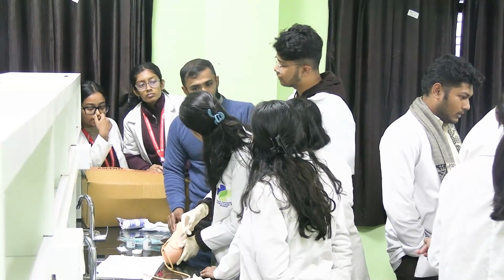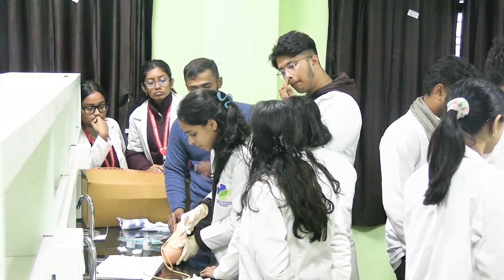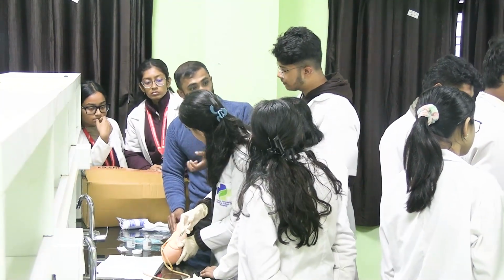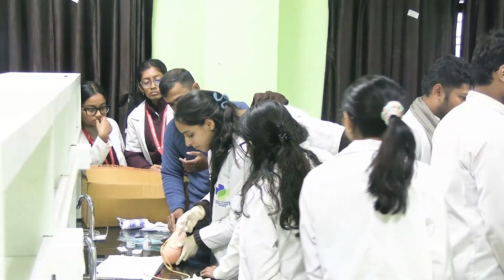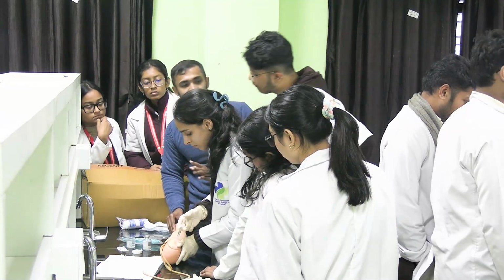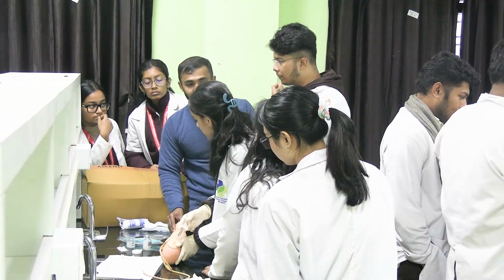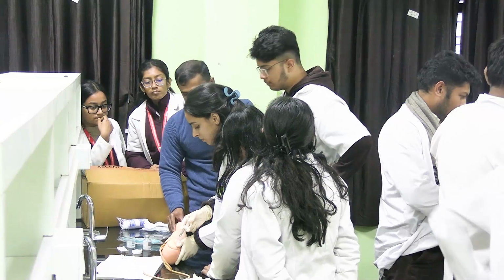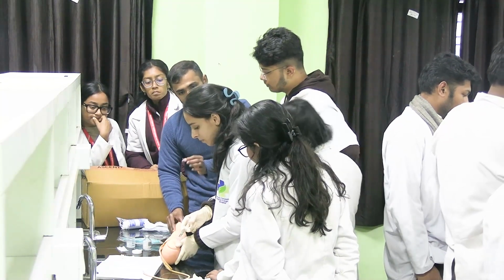We have to check whether it went into a blood vessel, because the muscle is more vascular, with more blood supply. To check, we have to aspirate, or withdraw the plunger. If blood comes, then we'll back off, remove the needle, and go to a new site with a new needle. If no blood comes, then it is safe. Now you can introduce the drug into the muscle.